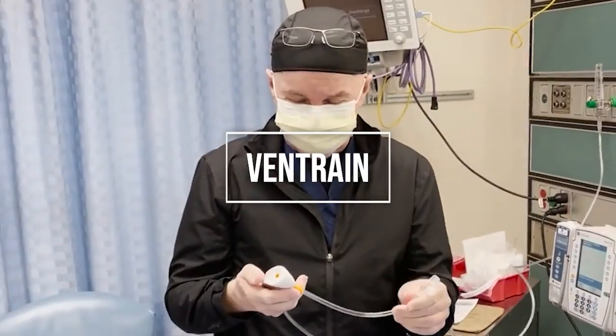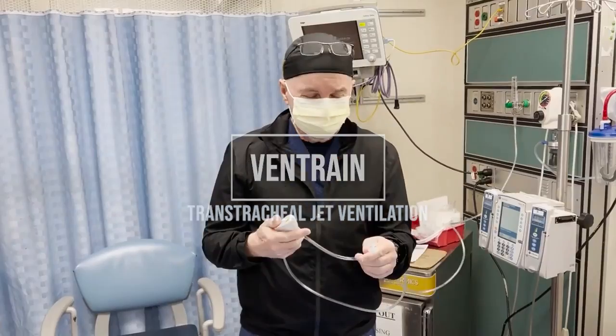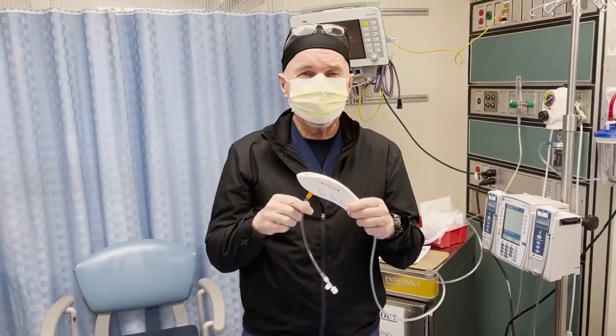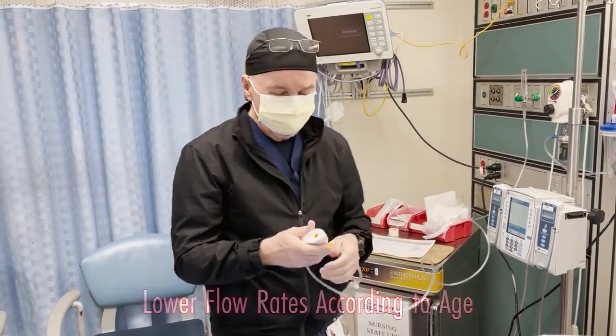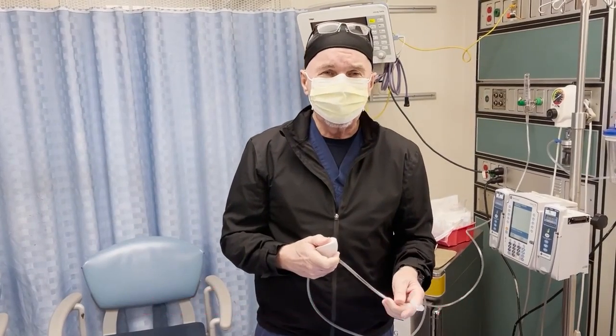This is a Ventrain. Basically, this is for a needle cricothyroidotomy, and it is an interesting piece of equipment. It's been around for about 15 years, but it can actually do active and passive removal of air.